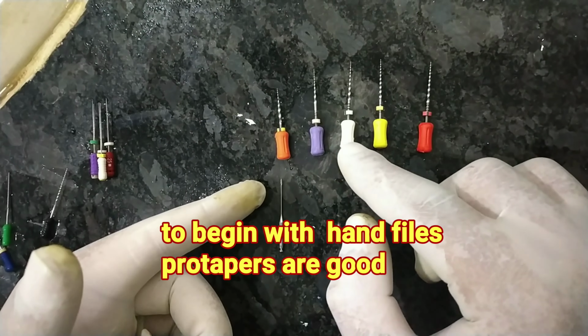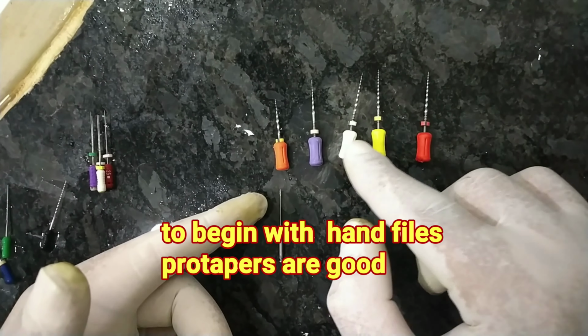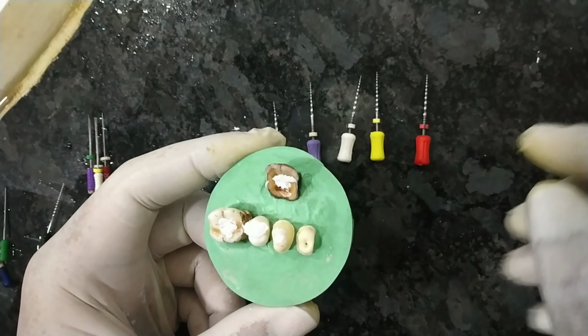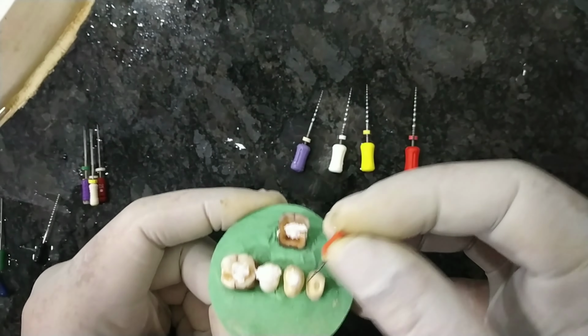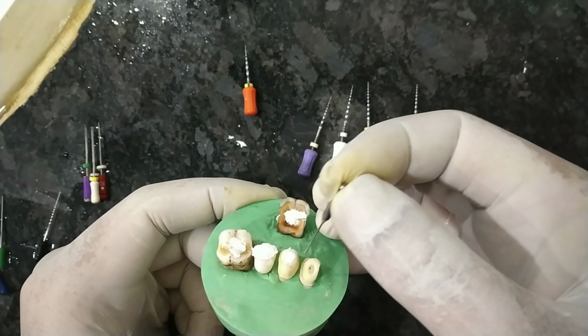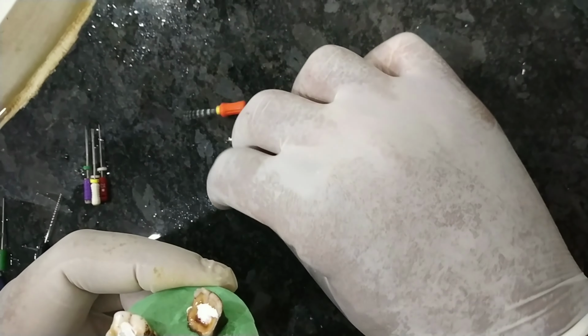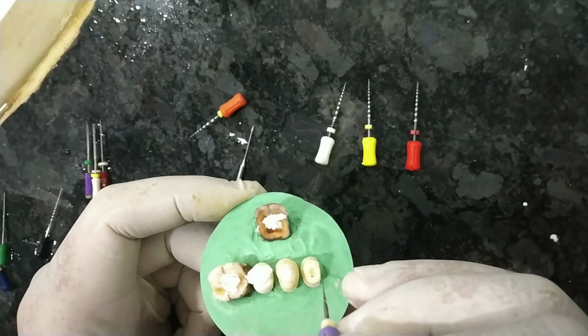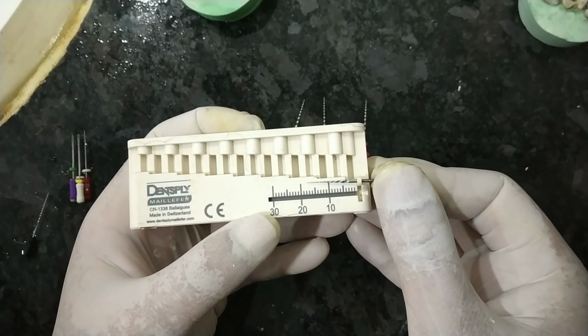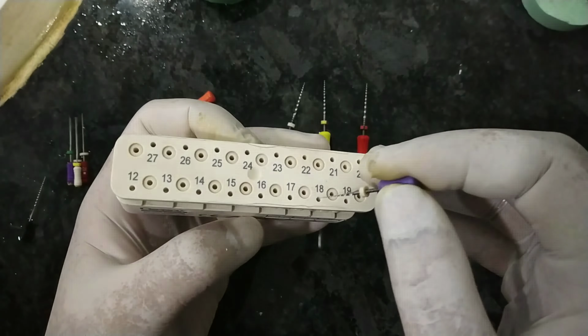Then is the S1, shaping 1, shaping 2, F1 and F2. Similarly, in this tooth, we have to use this SX, as I showed. SX you can use, or you can even use the Gates Glidden drill with the micromotor. Then the shaping file, around 18 mm, you have to set it around 18 mm. So this is the endo block, we have to measure it till 18 mm.